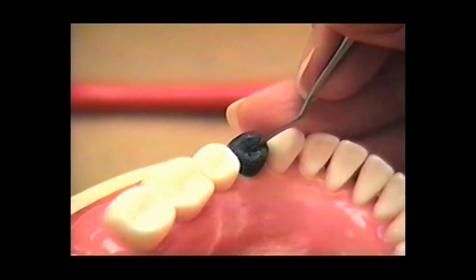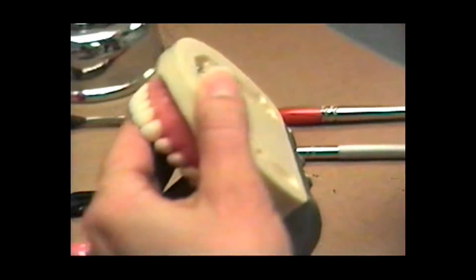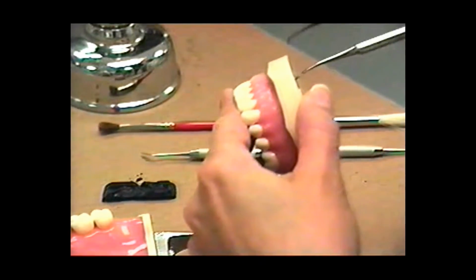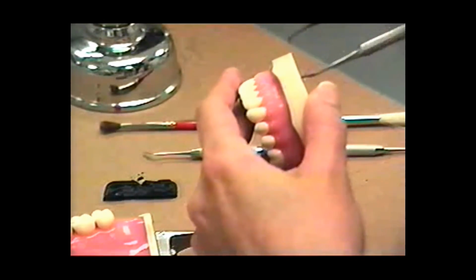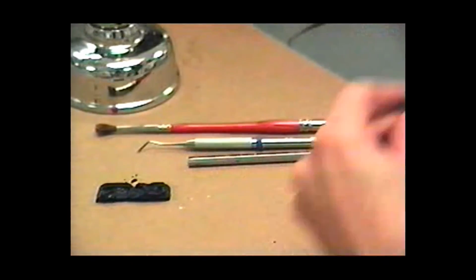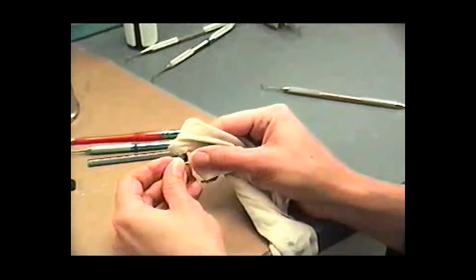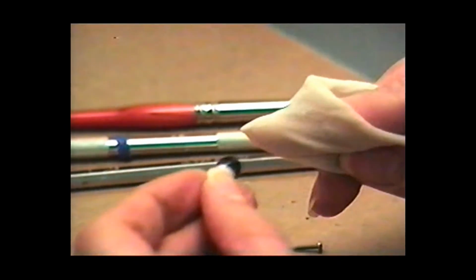But to get the axial part of your waxing nice and shiny, we can use a little nylon and smooth that. The main thing is, if you've done the job right, you don't have a lot of shining up to do to get the finish, because you kind of burnished it as you went along, and you got it just the way you want it. The other thing you have to be careful about is don't expect this to do wonders.